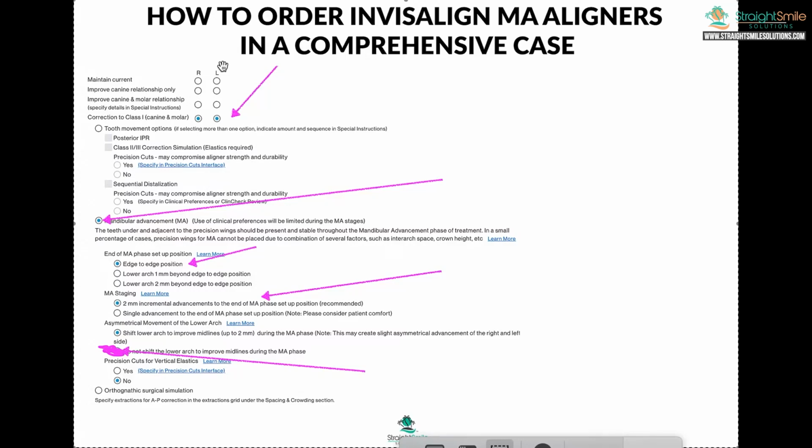It's on my phase 1 smile screening form. I've got videos on it. This is like a 20-minute conversation. It's a little sensitive in nature, but you can't be embarrassed to ask these questions. Also, if you don't want to ask the questions, or to supplement the questions, take a hand wrist x-ray. I came up with my own screening form on how to interpret the hand wrist x-ray.